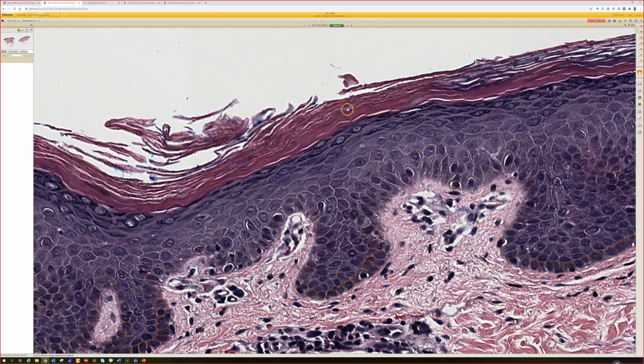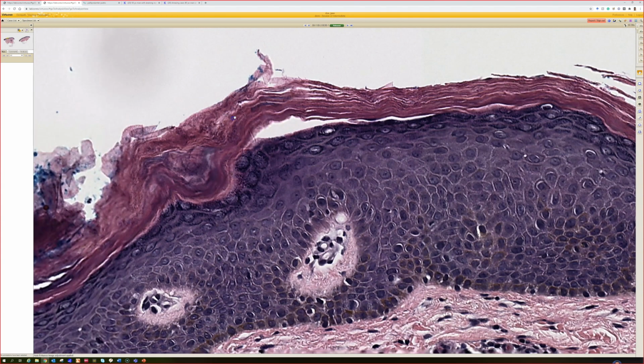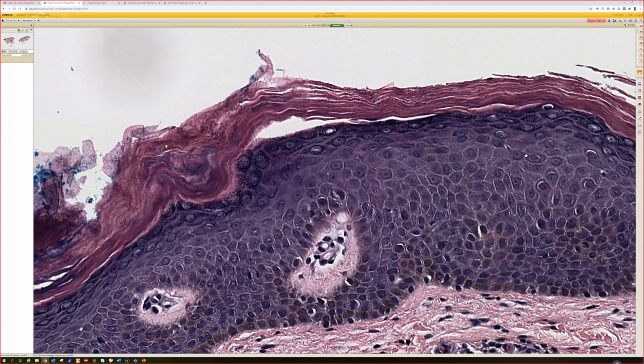So what if there were, which is what, there's some little blue smudgy stuff here, and I'll show you a better picture in a minute from a different case. But what would you think of if you see some little tiny organisms up here, much smaller than dermatophyte or fungus? Yeah, so if they're tiny, you think about erythrasma.